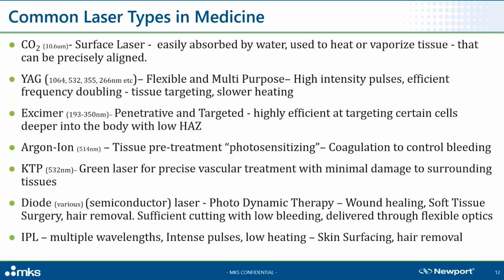So the CO2 laser is one of the oldest, most robust types of lasers. In the body, the only chromophore is water. This makes it a great laser for surface treatments, but a pretty lousy laser for selective targeting treatments or more penetrative applications. Think about it like a flamethrower that can be focused onto a pinhead. Very useful in certain applications, but causes too much heating in other applications.